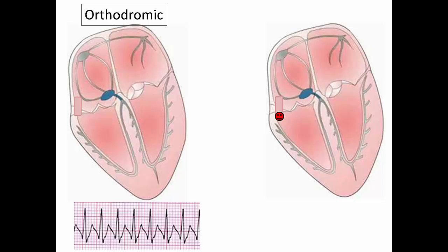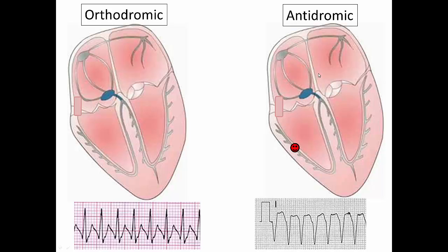And like I said, this is called antidromic, but notice something. It isn't going the same way through the bundle of His and everything else. So you're always going to have this pre-excitation. You're always going to have what we were talking about earlier, these delta waves, but these delta waves are coming so quickly. And so what we get are these really wide QRSs.